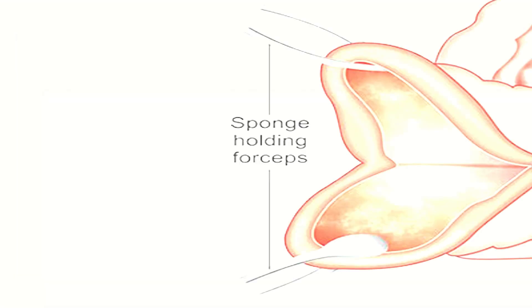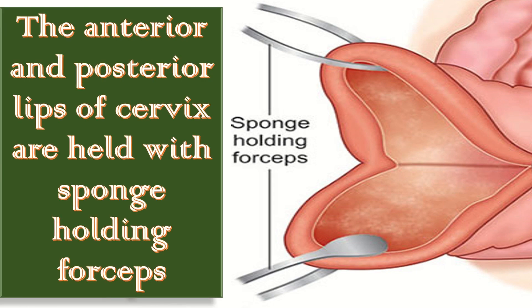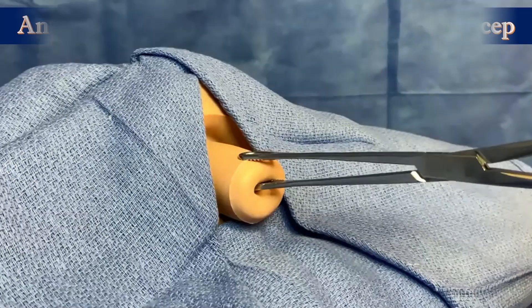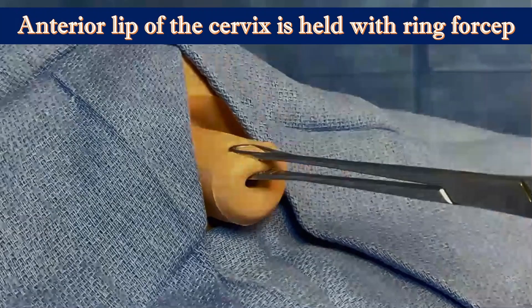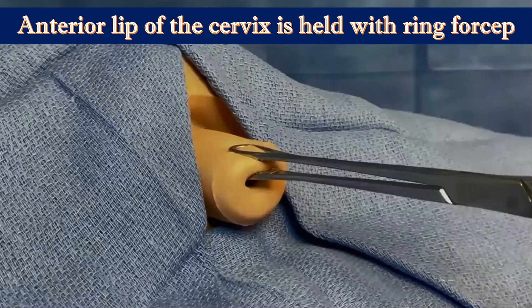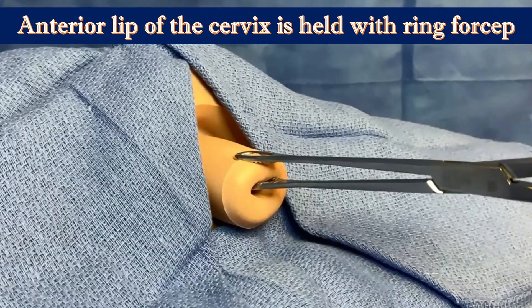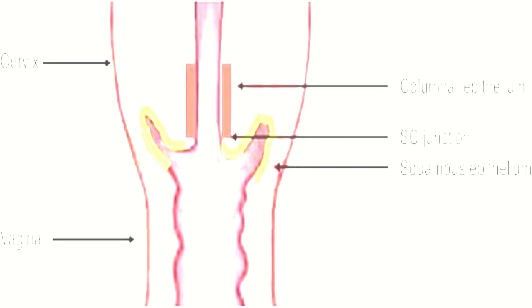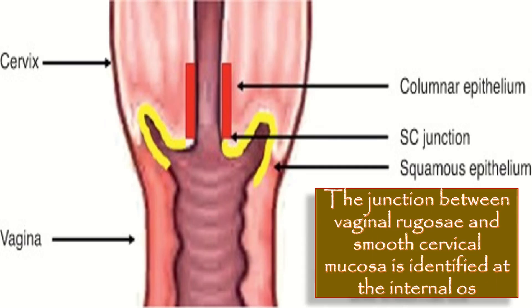The cervix is visualized using a Sims speculum. The anterior and posterior lips of the cervix are held with a sponge holding forcep and downward traction is applied. In this model, the anterior lip of the cervix is held with a ring forcep. The junction between vaginal rugose and smooth cervical mucosa is identified at the internal os.